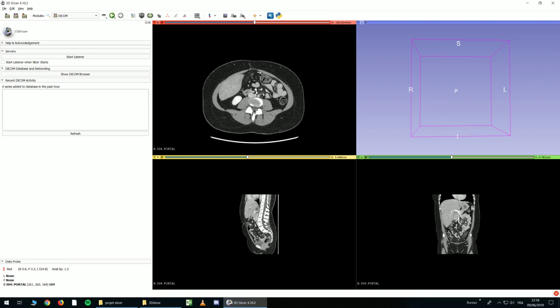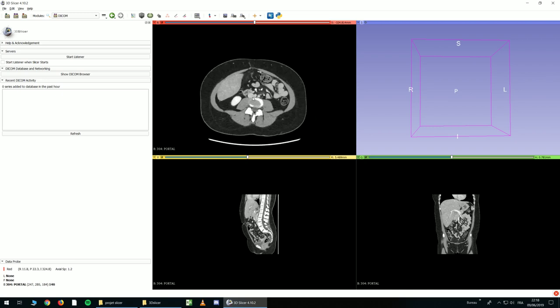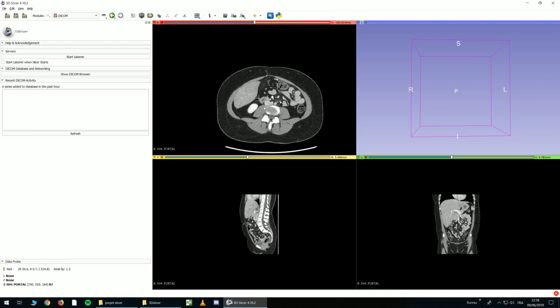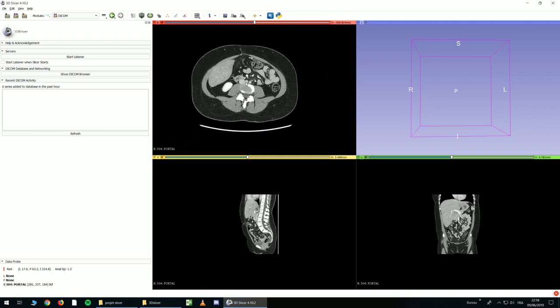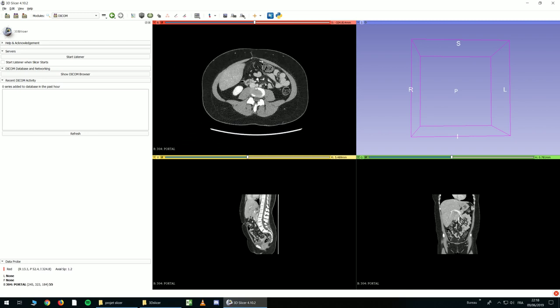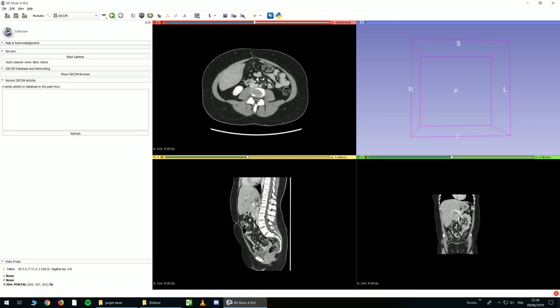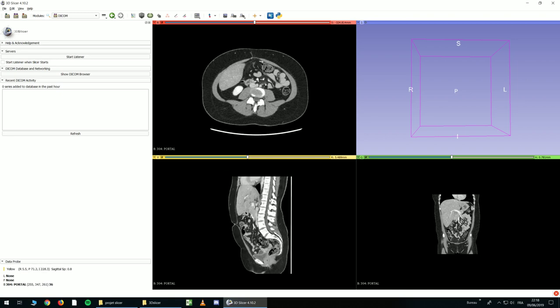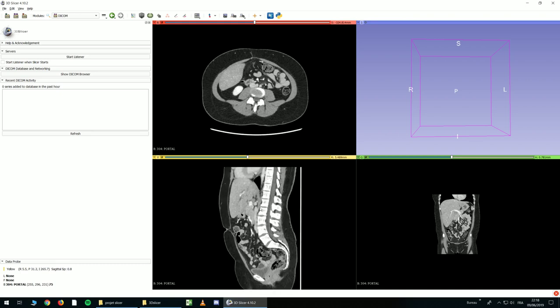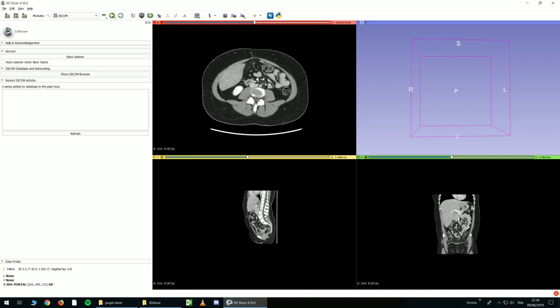So, right-click, and to center and move the whole image, you can click on the middle button. And you can also click on Control and use the scroll on the mouse to zoom and de-zoom.